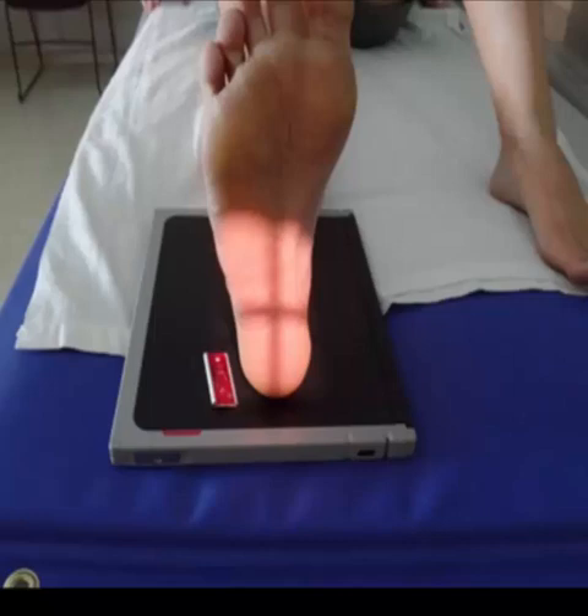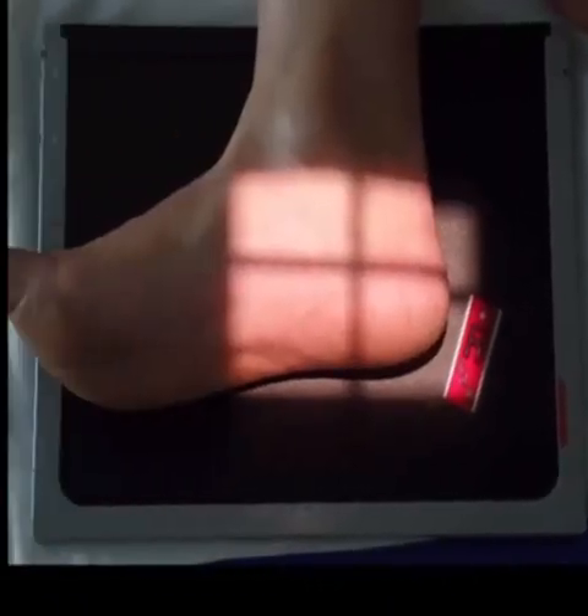Once you have completed the axial, you are now ready to position for the lateral. For this, have the patient roll onto their affected side.